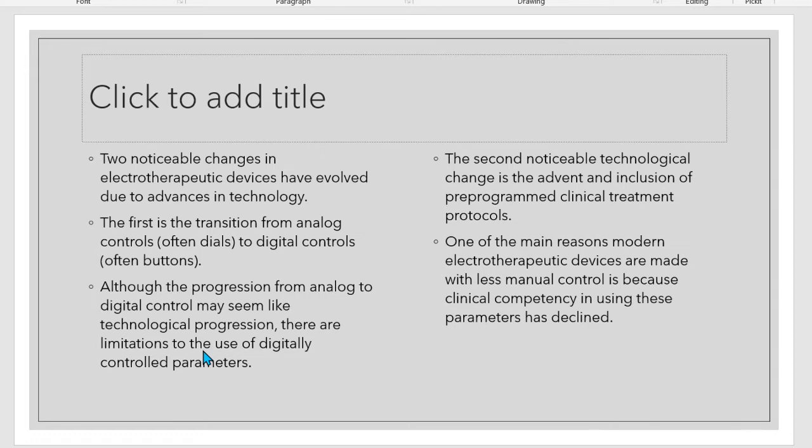Now, due to improvement of technology, there are a lot of changes in our electronic or electrotherapeutic devices. The first is the transition from analog controls to digital controls. With digital controls, you can easily read the parameters. You can now set your parameters and easily monitor them.